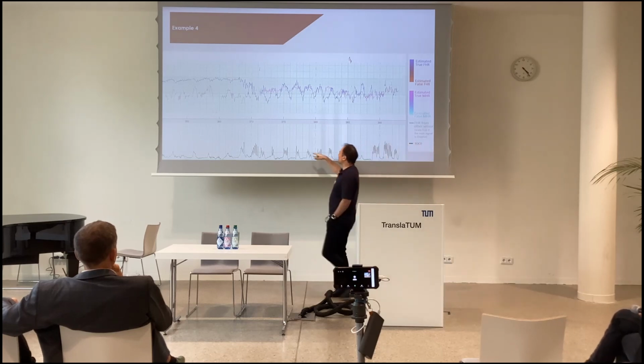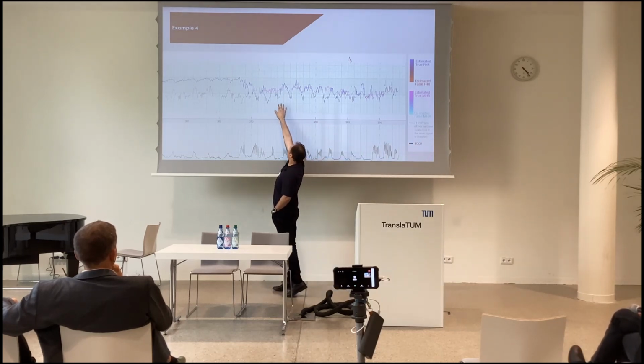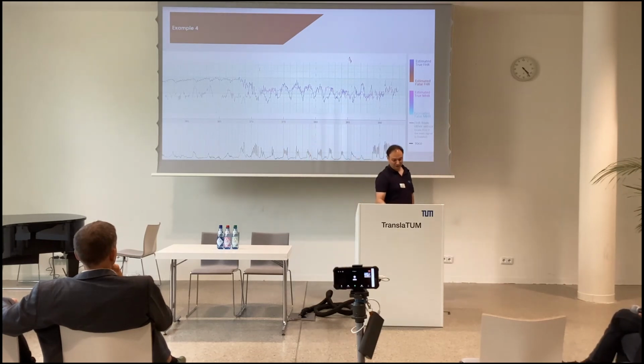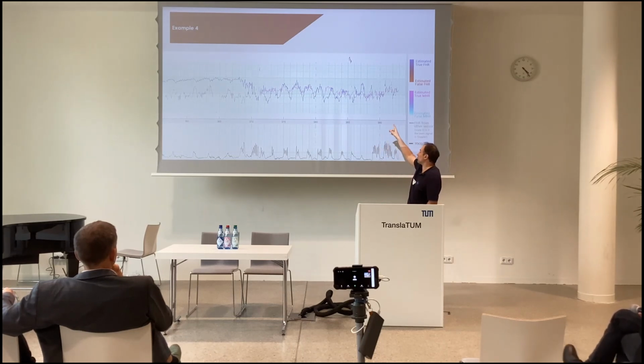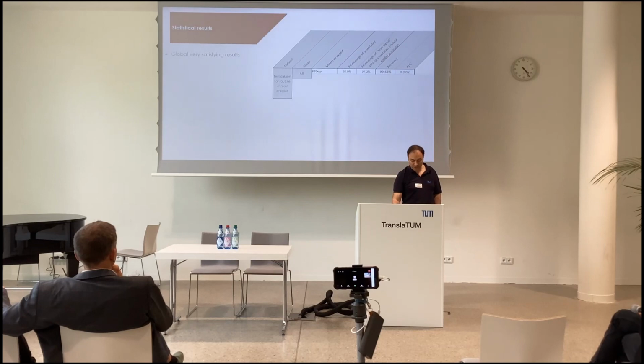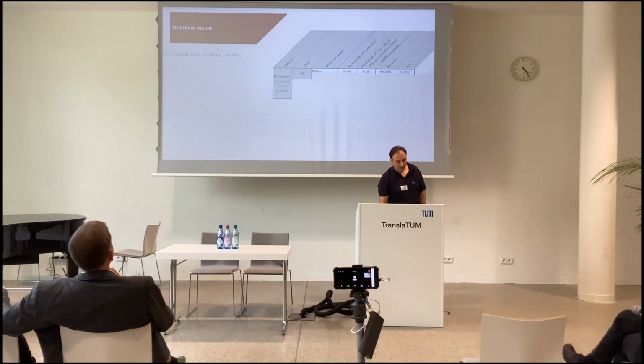We can almost say that this is acceleration synchronized with contraction, but the matching between the maternal heart rate and the fetal one is not perfect, so we can estimate it is probably a real signal.